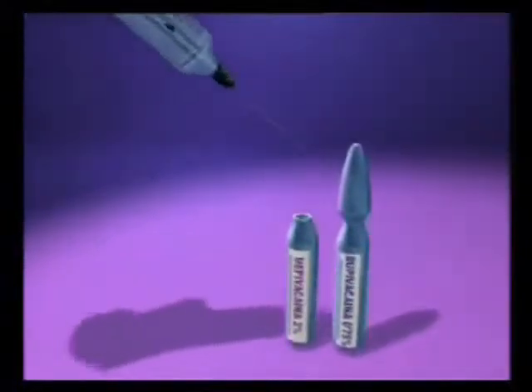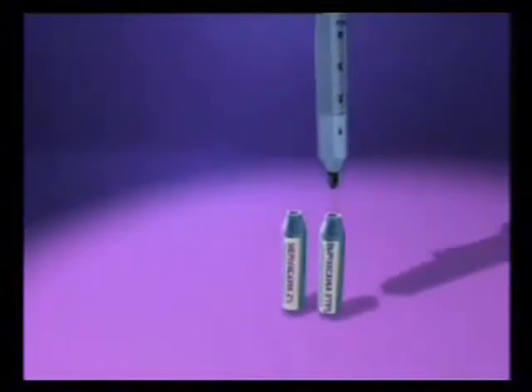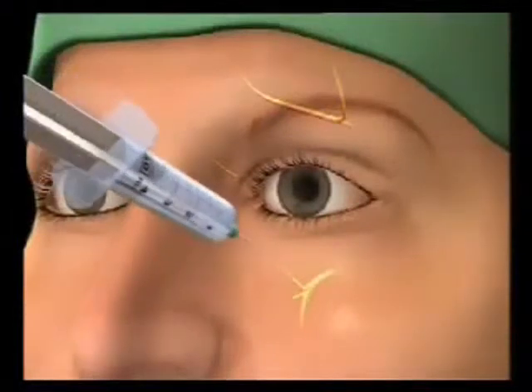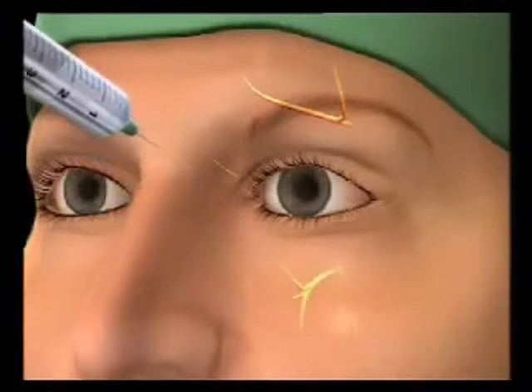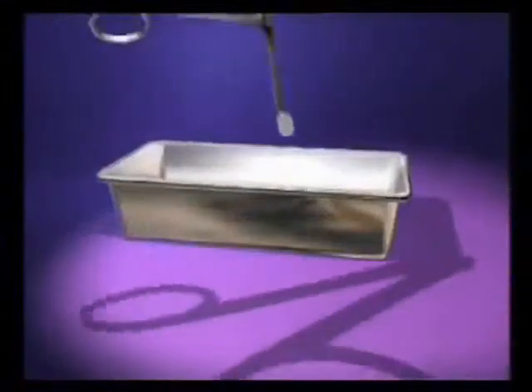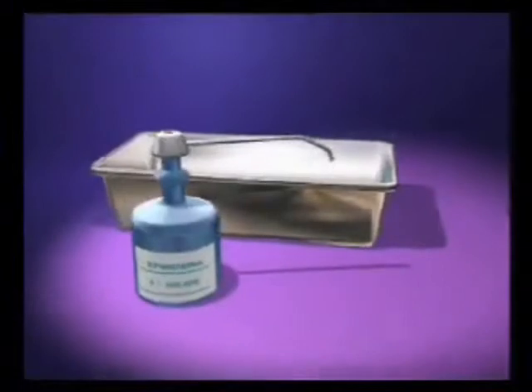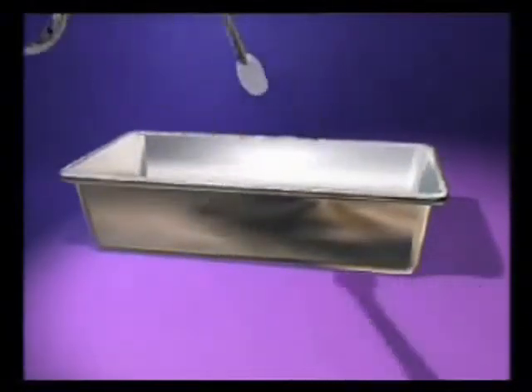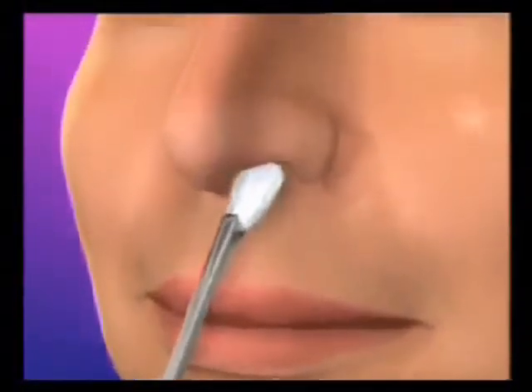The local anesthesia, a mixture of 1.5 milliliters of mepivacaine 2% and 1.5 milliliters of bupivacaine 0.75%, is infiltrated in the nasociliary area, blocking the infraorbital and infratrochlear nerve with 1 milliliter of anesthesia in each area. For the topical anesthesia, a cotton swab is impregnated with a mixture of tetracaine 1% and epinephrine 1/100,000 and placed in the nasal fossa about 15 minutes before surgery.